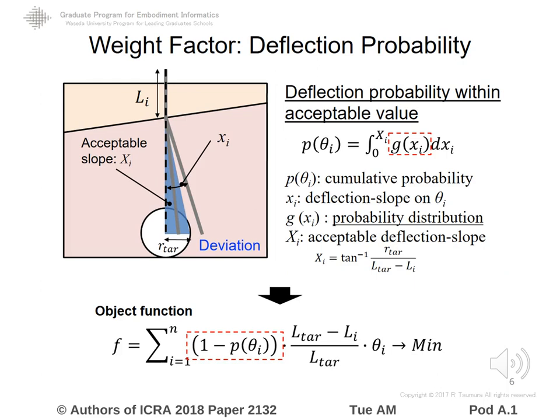The deflection also differs as a result of mechanical properties of the tissues, but it doesn't seem realistic to estimate the deflection considering uncertain factors such as viscous elasticity. Therefore, instead of estimating the deflection value, we consider the probability the deflection occurs as a result of insertion angle and mechanical properties of the tissue. By considering the probability, the effect of those uncertain factors, which are difficult to be included as parameters, can be effectively captured in the path planning.